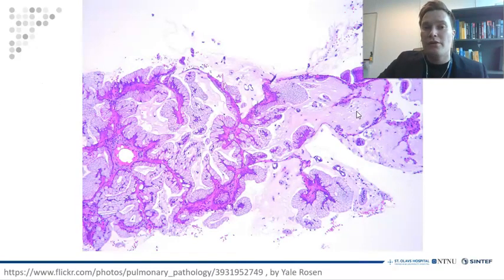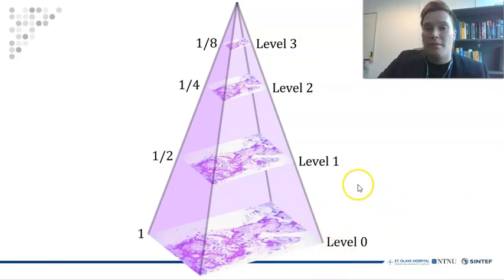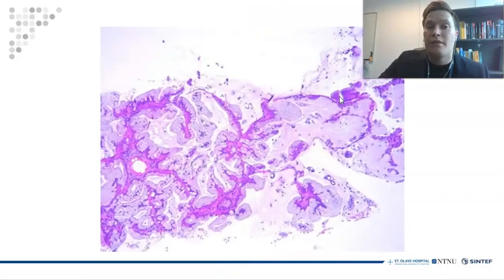As an example, I will use this small region of a whole-slide image of lung cancer. Now, images of the size of whole-slide images cannot be stored directly in memory, and thus these images are commonly stored as image pyramids. The overall idea is to store several downsampled versions of the same image. That way, if one wants to visualize the overall section or run some algorithm, one could use one of the lower resolution planes. Now, let's just choose one downsampled version as an example.